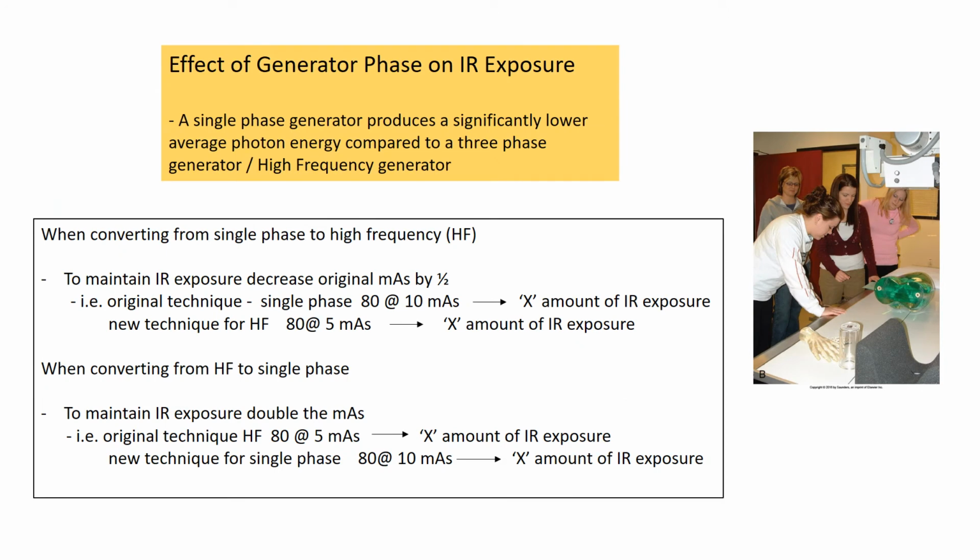Effective generator phase on IR exposure. We talked a little bit about this, and I said that it really probably isn't going to make too much sense to you right now because you don't know what generator phase has to do really with creating your image. We'll get more into that in physics.